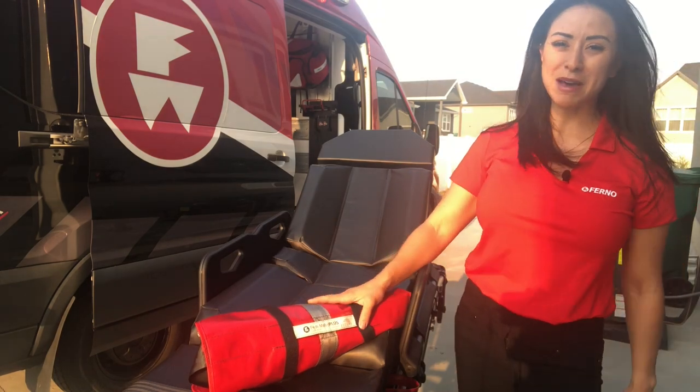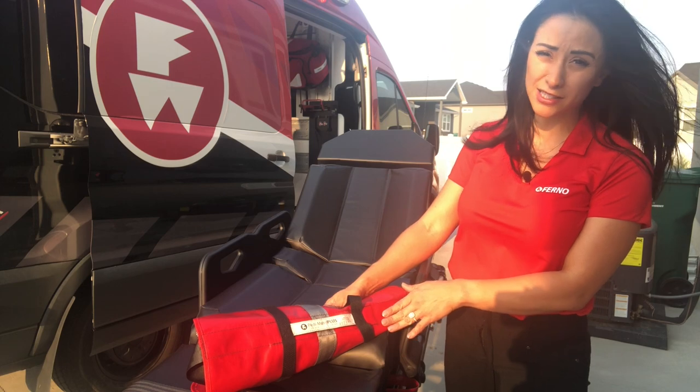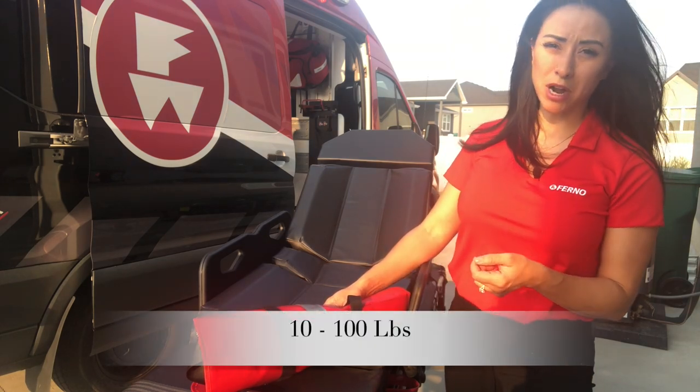Hey guys, Kendra Watson here with Furno EMS. Today I'm going to go over how to properly install the PD Mate Plus. This works for your kids, your patients from 10 pounds to 100 pounds.